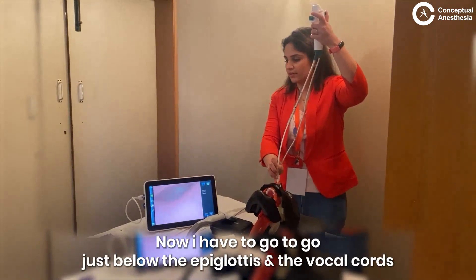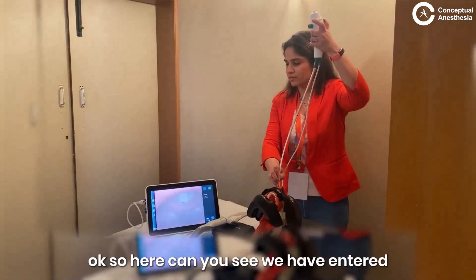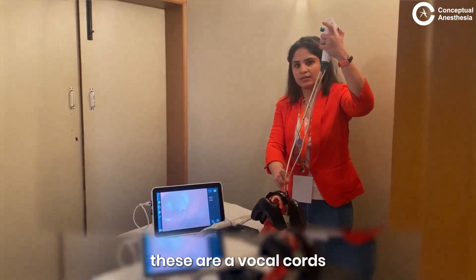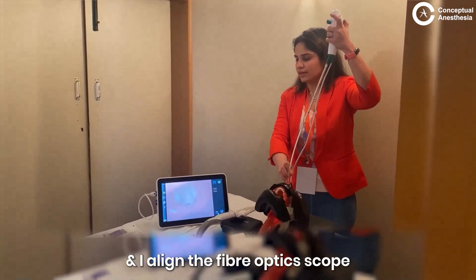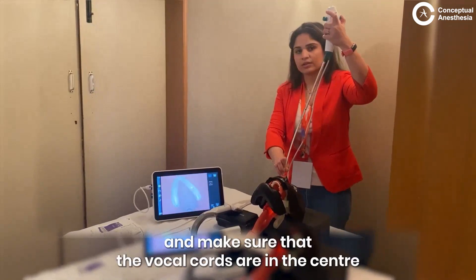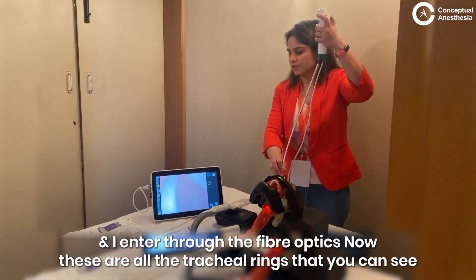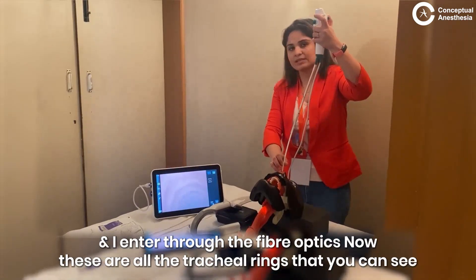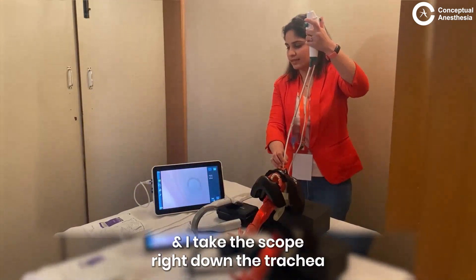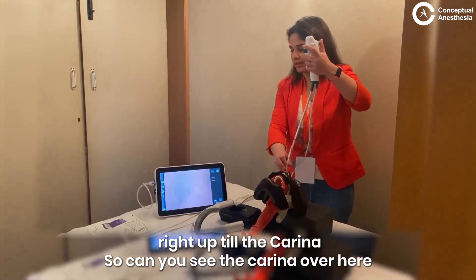I have to go just below the epiglottis. Here, can you see we have entered? These are our vocal cords and I align the fiber optic scope, making sure that the vocal cords are in the center, and I enter through the fiber optic scope. These are all the tracheal rings that you can see and I take the scope right down the trachea right up till the carina.